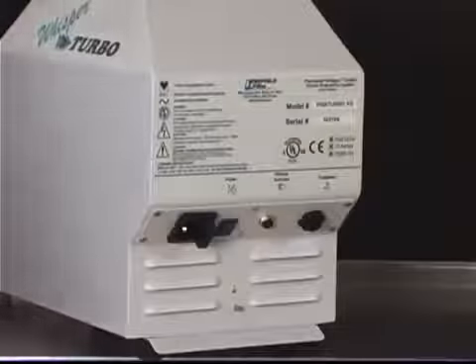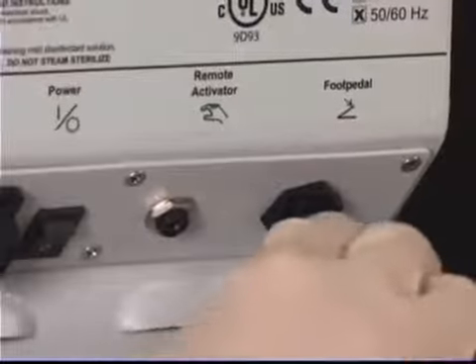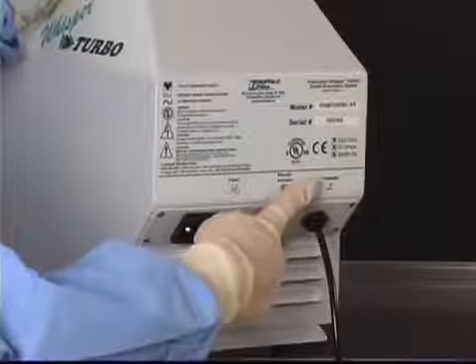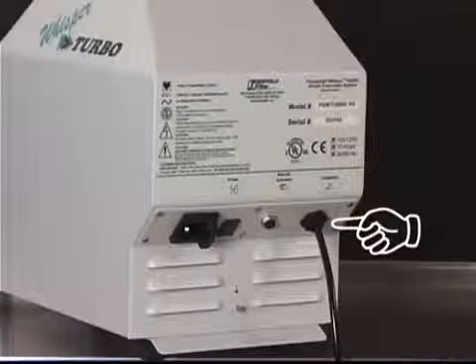To set up the system, first connect your pneumatic foot switch to the unit by sliding the foot switch tubing into the outlet located on the back of the system marked foot pedal. Slide the tubing into the outlet until it fully seats in the opening and cannot slide in any further.